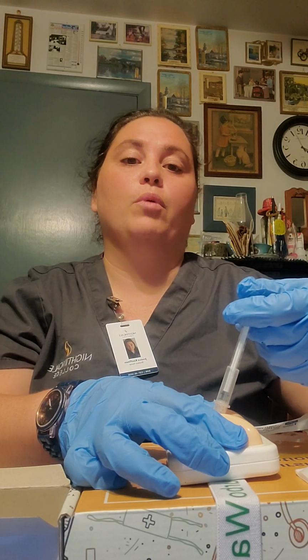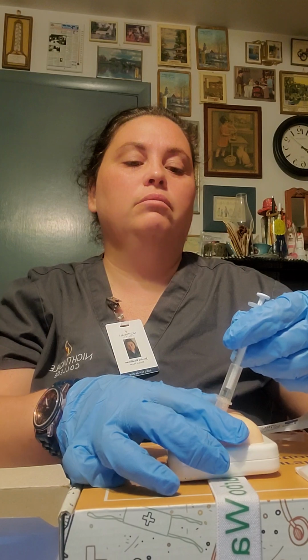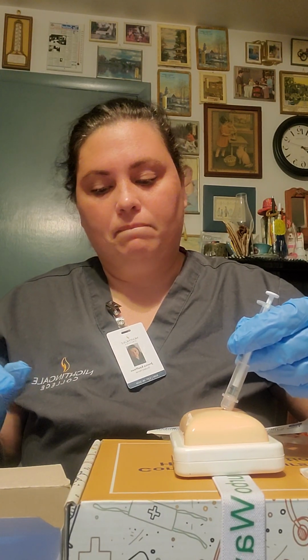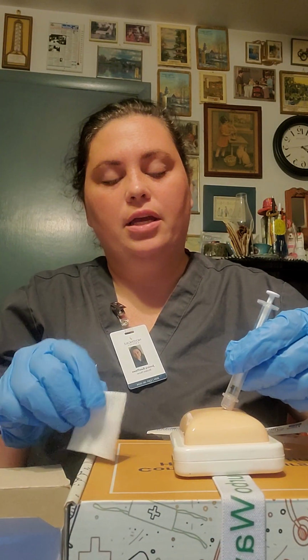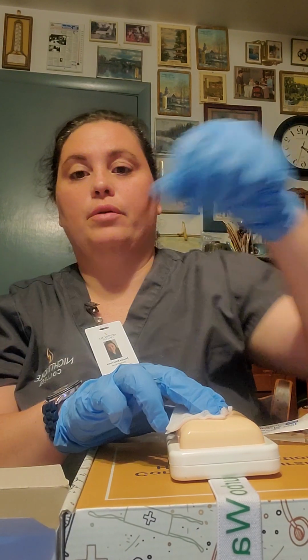I would wait a few more seconds before pulling my needle out. I'm going to get my gauze here. Alright, I waited long enough, so I'm going to put my gauze down and pull my needle out. I'm going to put this in my sharps container.